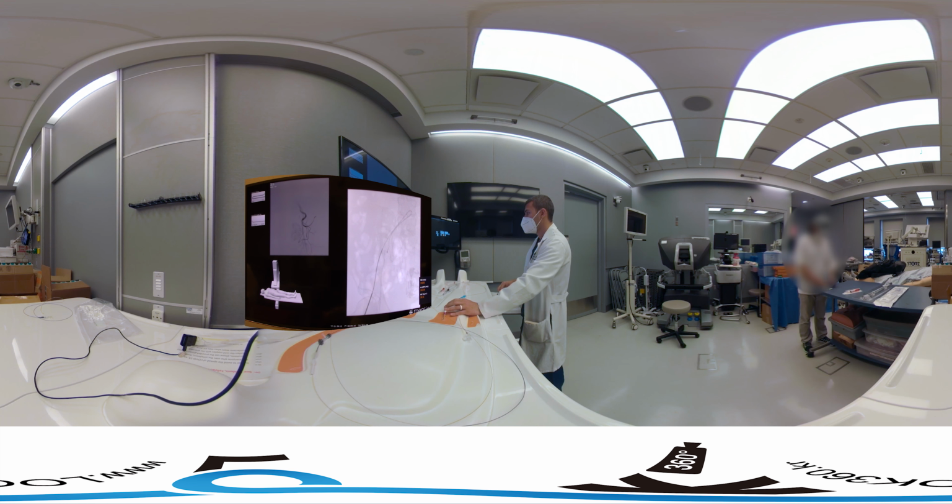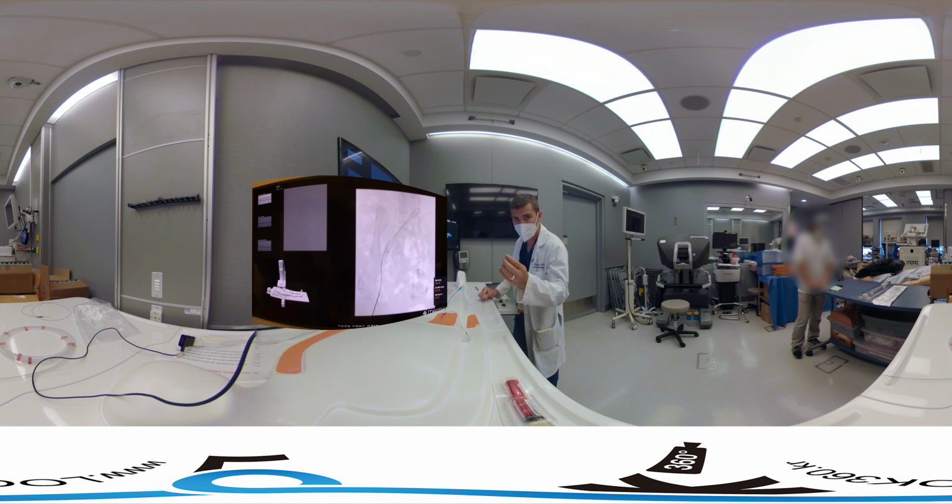So now for the next part, we're going to be using the microcatheter. Okay, so for this next part, we have the microcatheter here. Again, this is a smaller catheter that fits within our base catheter. It's usually somewhere between 2 and 2.8 French, so this is going to be 2.4 French that we're going to use. And also we're going to be using an 014 wire, a very small wire that allows us to select those small branches that we're going for. I'm going to introduce this into our base catheter just to get started.